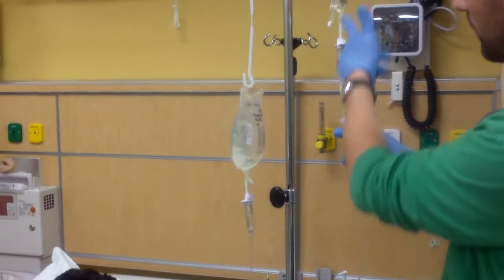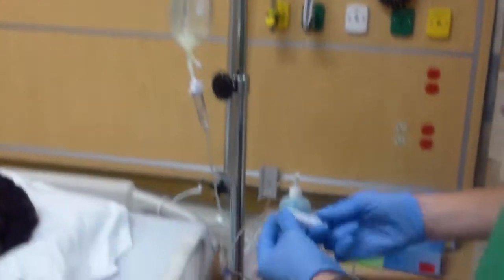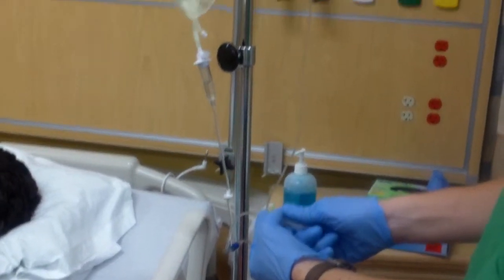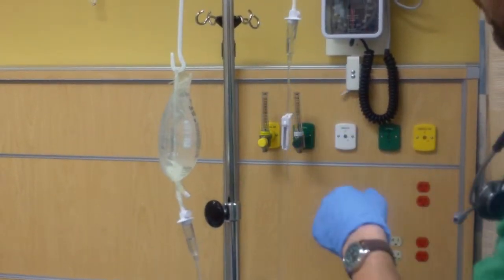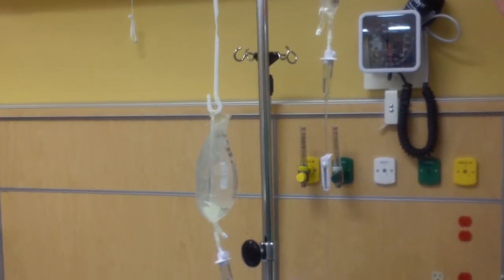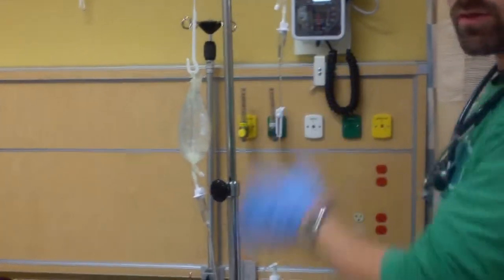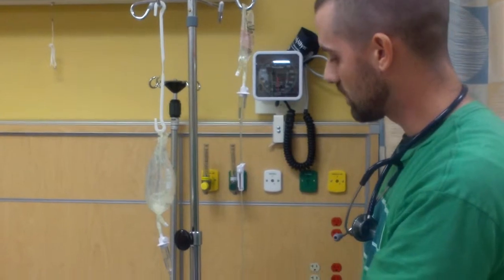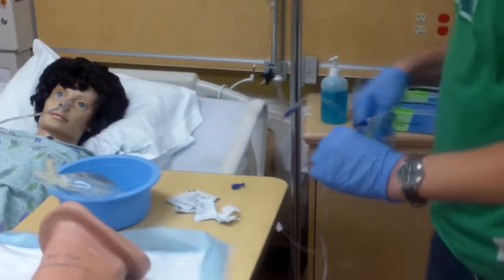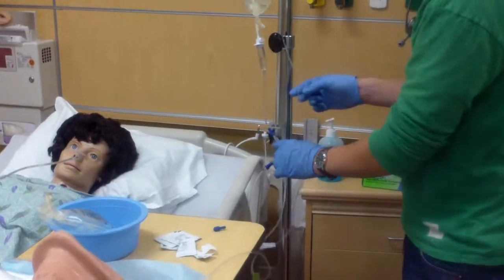So then I'm going to open up my secondary, and this is where I would set my drip rate with this one. I would just know my drip rate. I would slowly open this up until I got my drip rate there. And I would set my drip rate, and I would also note that if it's the same drip rate, then I can just let it go at the same drip rate, but I would need to monitor this closely if these two are different drip rates. So then once that's set up, I'll let that go. I don't want any of my IV on the floor, so I'm going to hang it up. It should work.